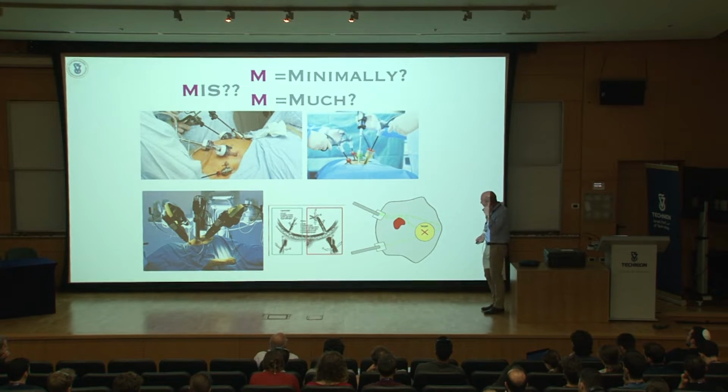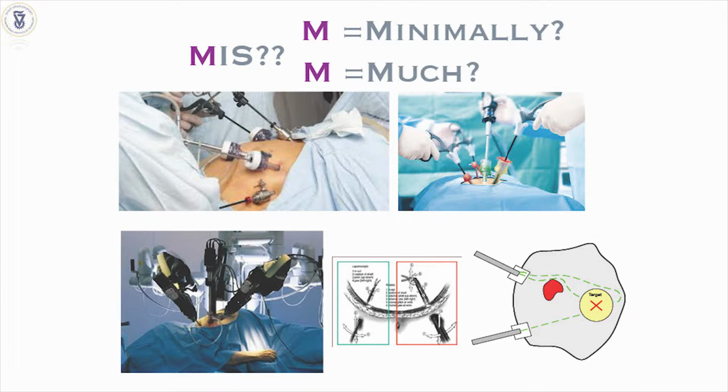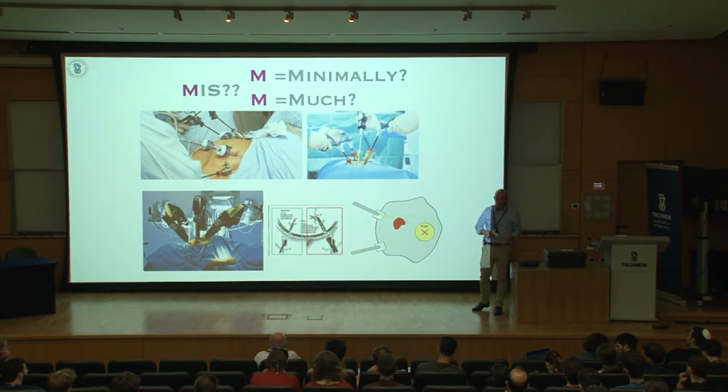So with that in mind, we came up with the idea, let's take the snakes, which we had for search and rescue, which are good for minimally invasive surgery, and try to shrink them down a little bit to something that can be used on humans.